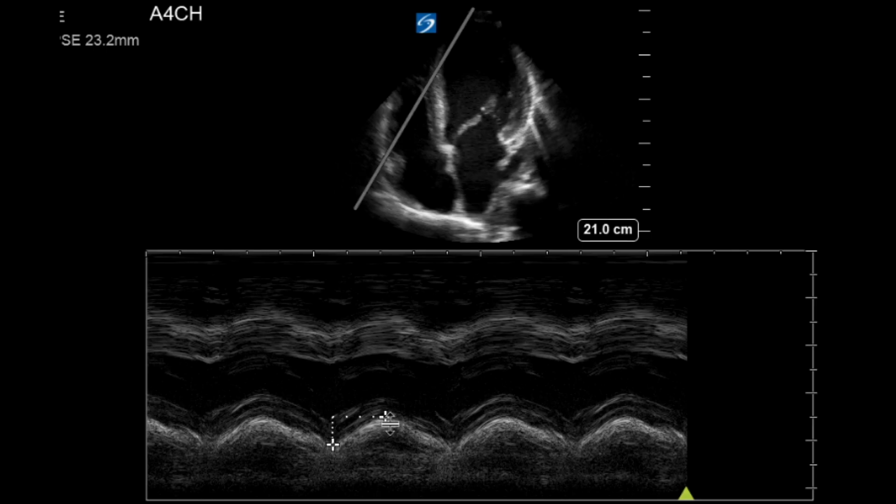That means that the heart is moving well, or the right heart is moving well. But when you have right heart strain or RV hypokinesis, sometimes you're not going to have that up and down movement in that area. So your measurement is going to be lower than usually 16 or 17.